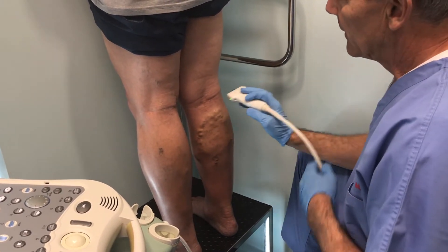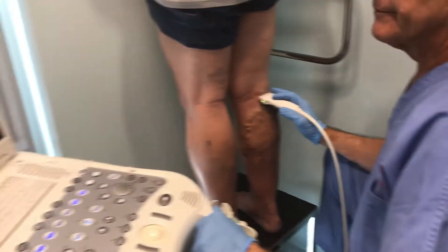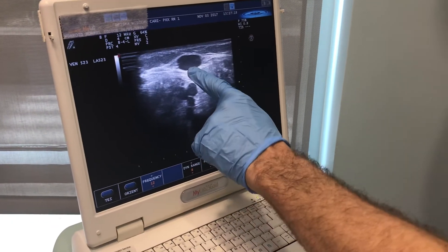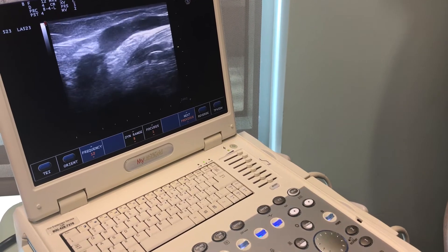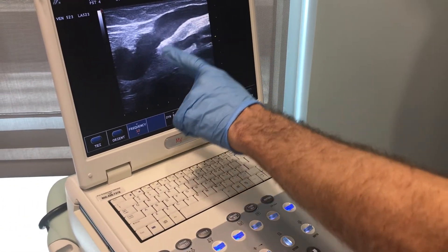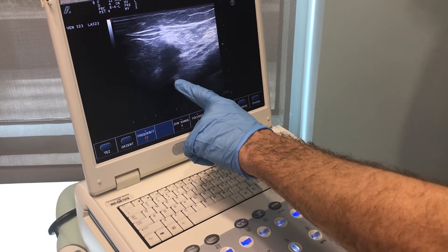I'm going to show you on our ultrasound when we see a patient like this. Basically what I'm doing is I'm looking through his skin, and this round thing is the vein. This is the superficial pipe that's bringing the blood up his leg and taking it into his deep system, which is right here.